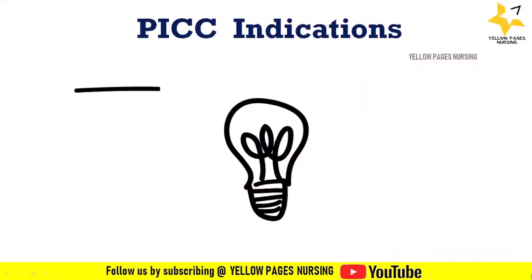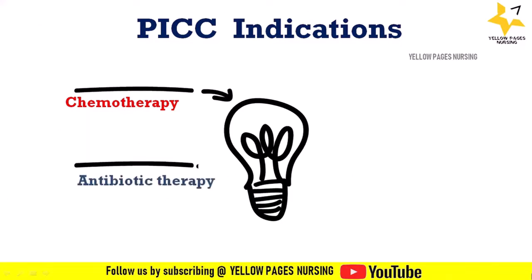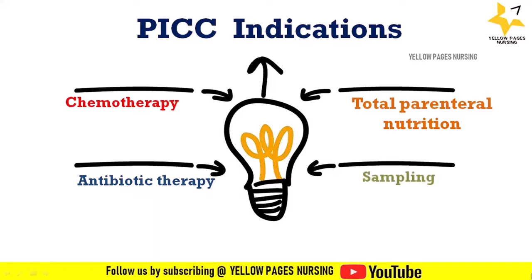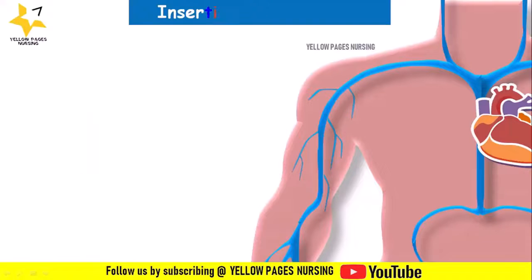Coming to the indications of PICC line. PICC line is indicated in cases of chemotherapy, continuous antibiotic therapy, total parenteral nutrition, and for sampling purposes. PICC line is contraindicated in case of renal failure and dialysis because preservation of upper extremity veins is needed for fistula or graft implantation.